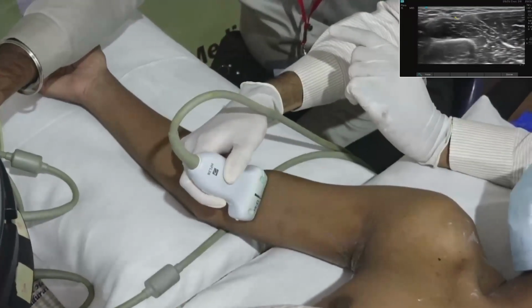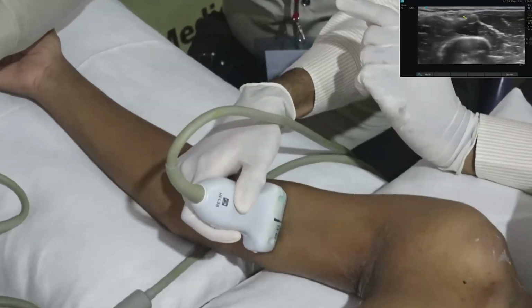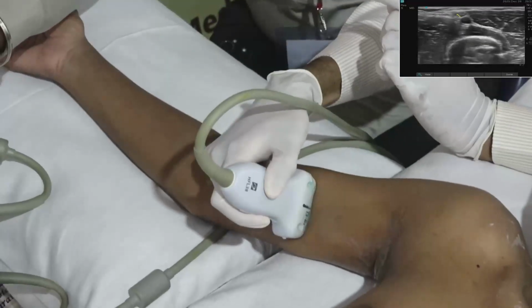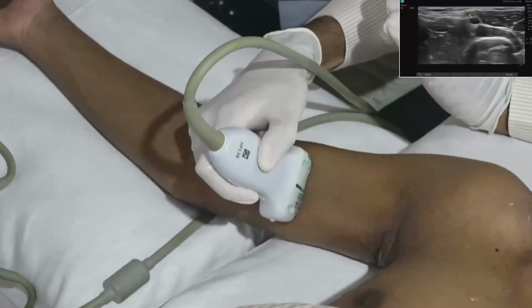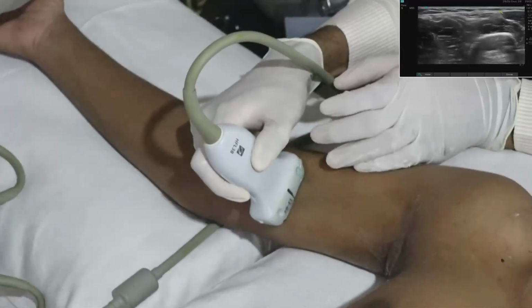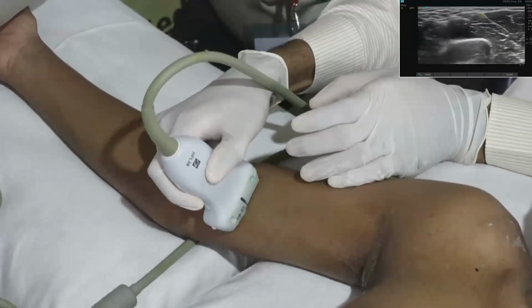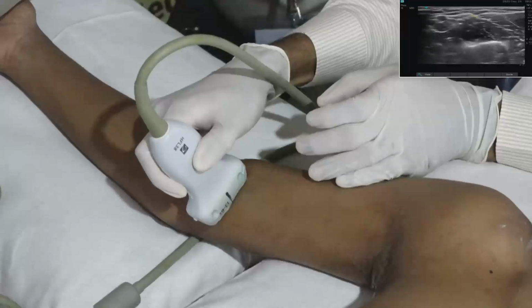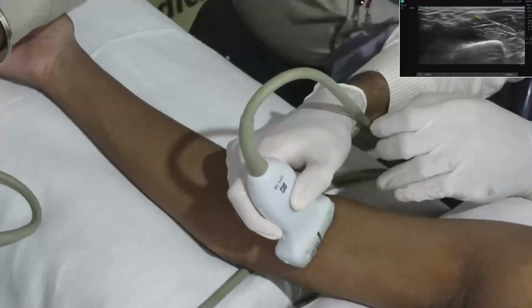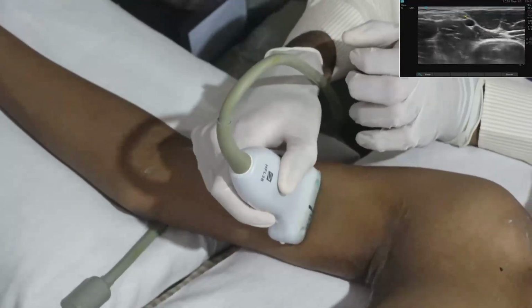If I am tracing it towards the axilla, the famous saying is brachial artery, and the median nerve is married to the brachial artery, always with the artery from the elbow. If you see, I am scanning again distally. So the median nerve now is exactly in the 11 o'clock position of the artery.